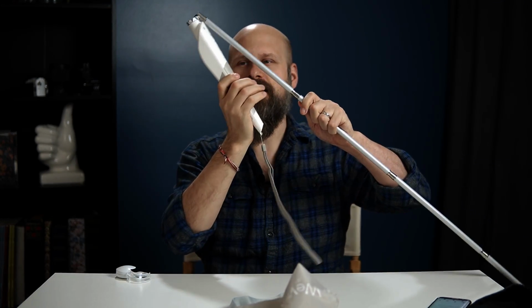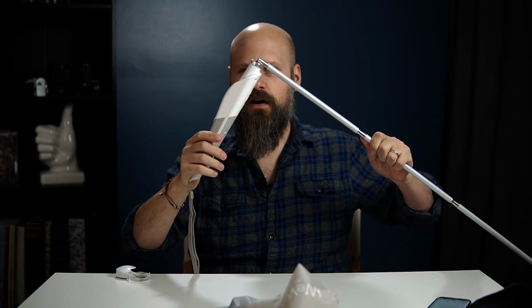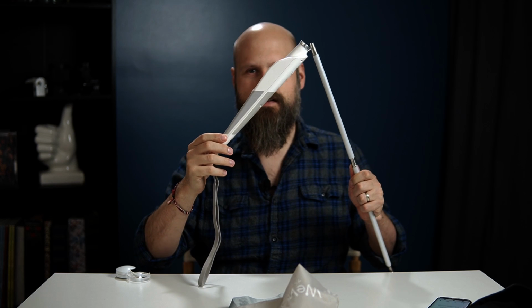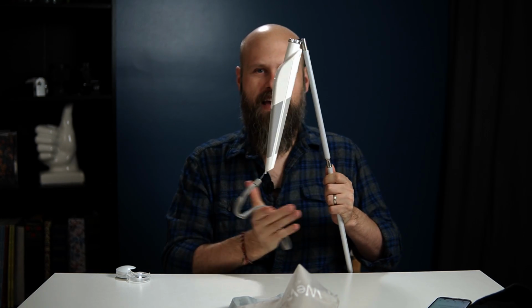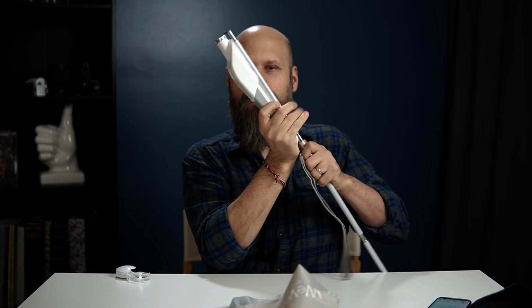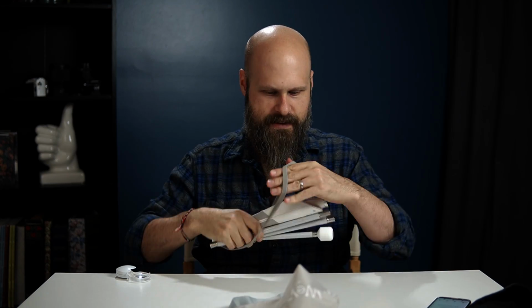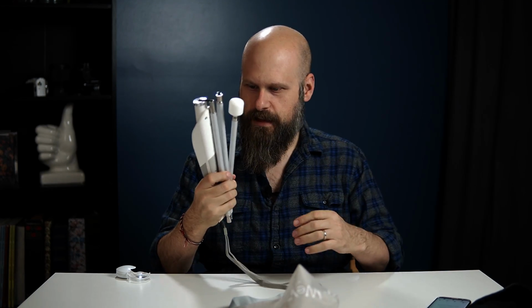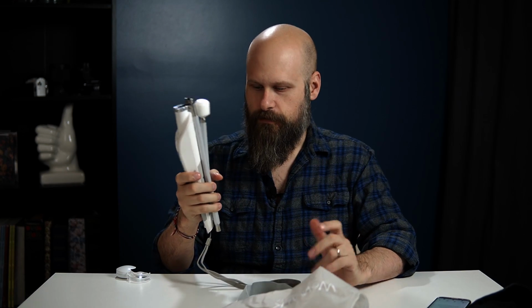Closing the cane is a little strange also, because when you fold up the first section here, the top handle section, it doesn't want to lay flat against the cane. So you kind of have to pull it out a little bit and then hold it flat, and then you can fold up the rest of the sections. But like I said, the strap doesn't do anything to hold it all closed, so you really need the bag to keep it all closed up and folded.